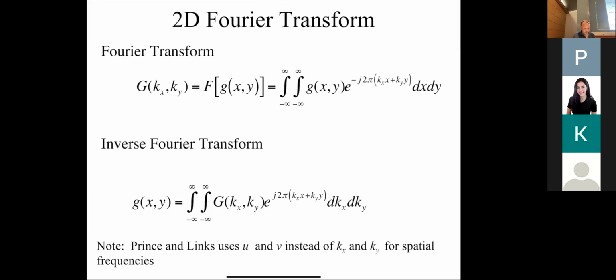Okay. And then the idea is this is the data that we collect. This is what's coming off the MR scanner, these coefficients. So then we take those coefficients into our computer and then we compute the image. Okay, so that's what MR is doing.